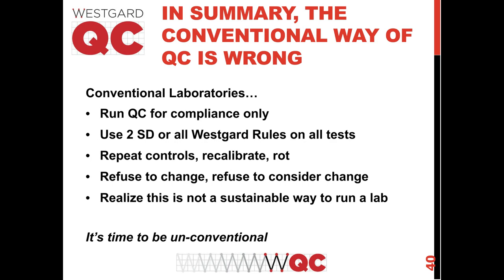And if you're refusing to make these changes, if you're refusing even to consider the idea of changing your QC, please recognize that this is not a sustainable way to run a lab. You have constant pressure to find savings, constant pressure to make the most of your scarce resources, and your scarcest resource is your tech time.